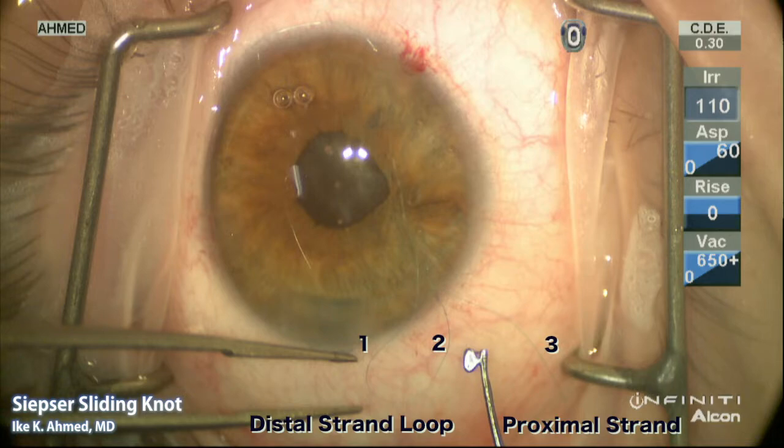Suture number one passes through the distal paracentesis, all the way through the eye, and emerges through the proximal paracentesis — it is not engaging the iris. The second strand, number two, is part of the distal strand and goes from the iris through the paracentesis visible on the conjunctiva. The third suture, the proximal strand, goes from the iris through the paracentesis on the proximal side.